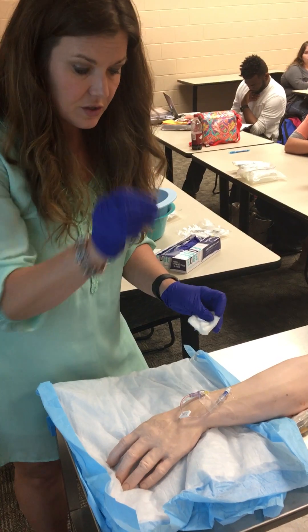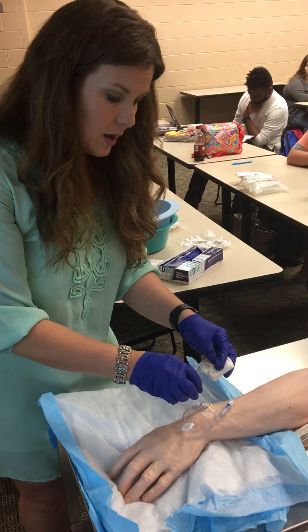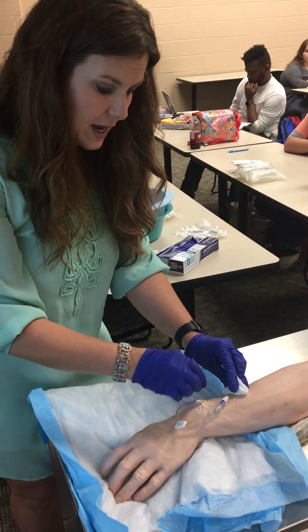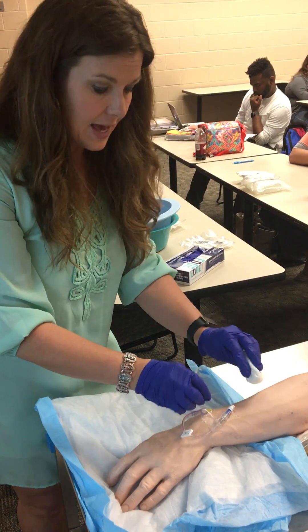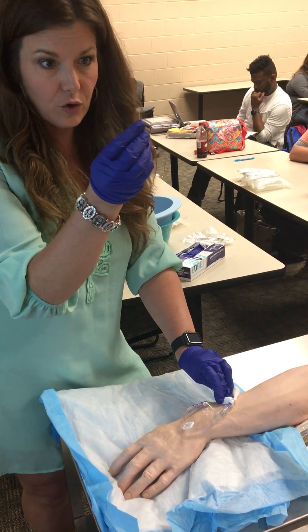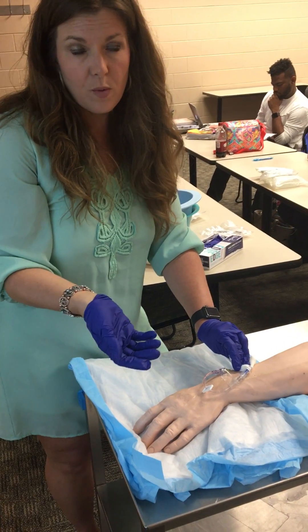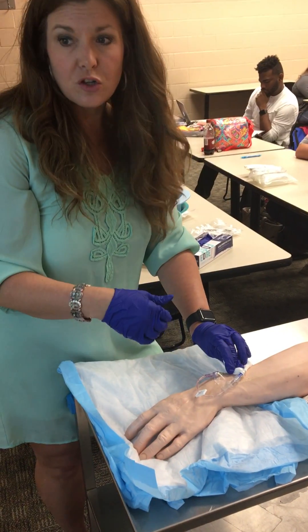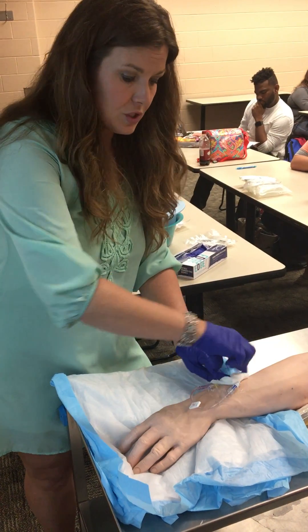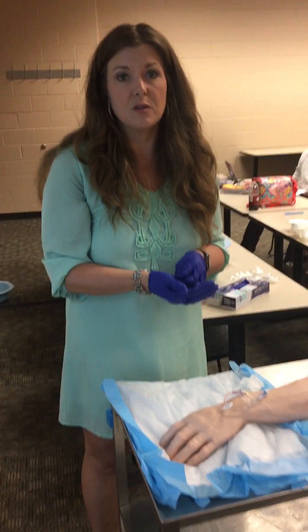We'll have a little IV catheter here for pretend — we're not taking it out of the mannequin repeatedly since the arm is wearing down. Explain to the patient what you're going to do the whole time. As you pull out, pull it straight in line with the vein, assessing and applying pressure. Look at that catheter tip to make sure it's intact. Apply pressure for 2 to 3 minutes normally, or 5 to 10 minutes if they're on blood thinners. Then apply your dressing — a piece of tape, a Band-Aid, or a 4x4 until they quit bleeding. Always document and include the patient's response to the procedure.